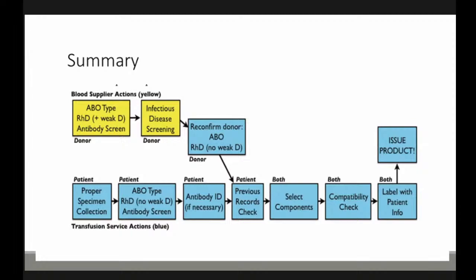We then issue the specific or selective components that are ordered by the doctor once we have done the compatibility testing. We label the units with the appropriate labels for the patients, and we issue the product.